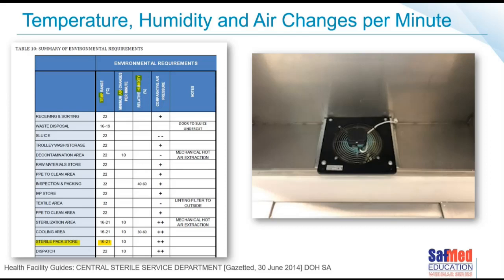I remember a few years ago being at Africa Health and having the privilege of chatting to some of our colleagues from other African countries, and somebody in fact was from Rwanda and a little bit closer to the equator, where the humidity was horrendous, and apparently they just have water pouring down the walls, often in the operating rooms and in the CSSDs, because of where they are. We have some areas in our country, in Mpumalanga, where the humidity is also quite high. So very important to take into cognizance the temperature and the humidity in the area.